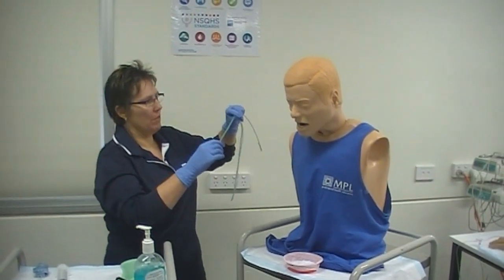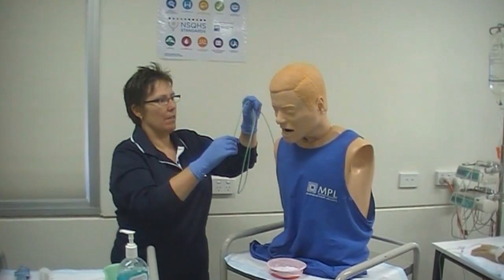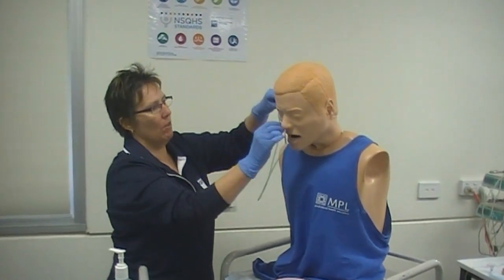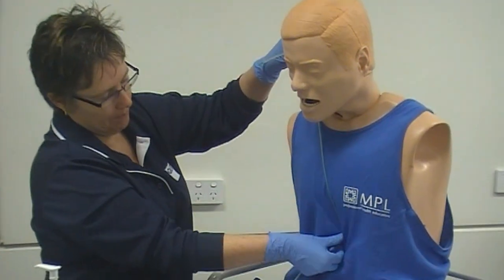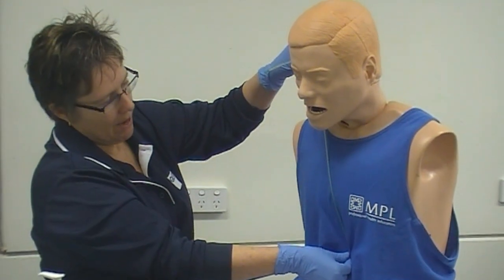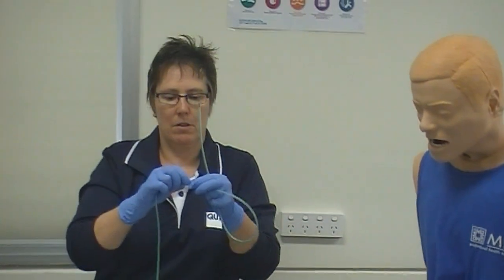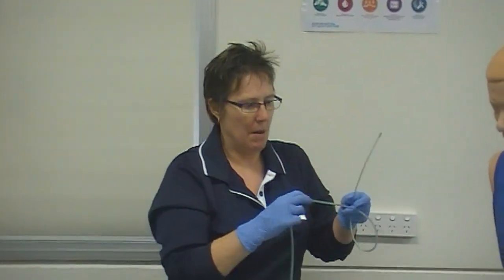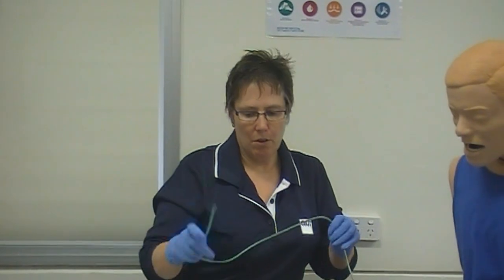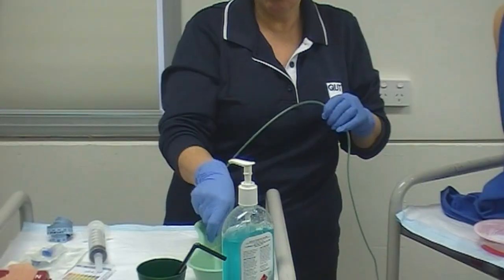Before I put the tube into the patient I need to think about how far I'm going to progress it. The usual measurement is from the nostril to the ear lobe and then down to the xiphisternum at the bottom here — that's the approximate measurement. I would mark that point with some tape or an indelible pen. Then I'm going to lubricate the tube with a nice bit of lubricant gel, or sterile water will do the job as well.